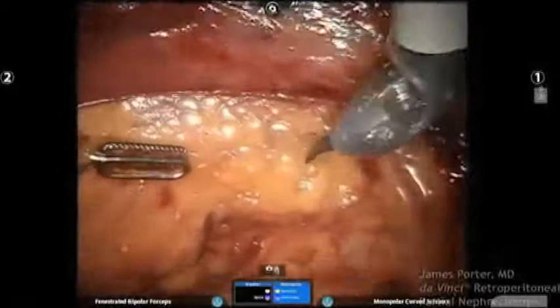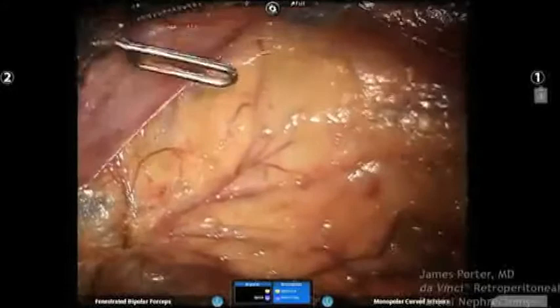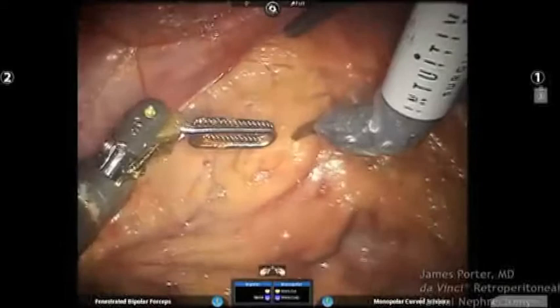Now, Ben, are you doing that routinely, or is this only for solitary kidneys? Only for solitary kidneys. Because I think that's Jamie Landwin's work, right, initially? That was Jamie, who had used a ureteral access. He had done a lot of early work using a ureteral access sheath with a double J stent. We've been using just a dual lumen catheter, and we found that that's been effective.